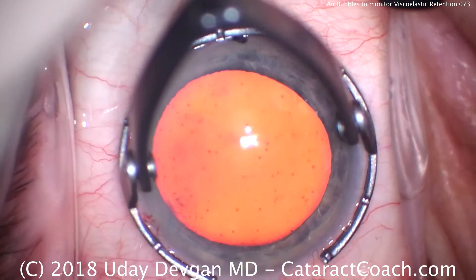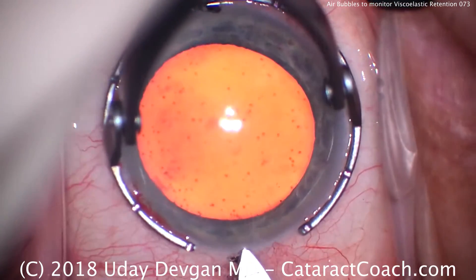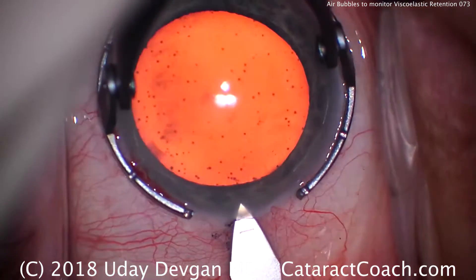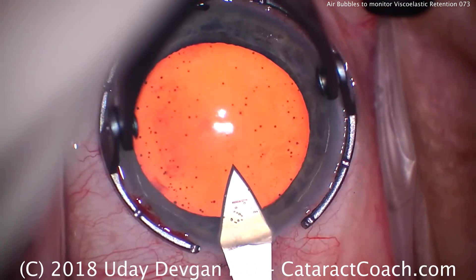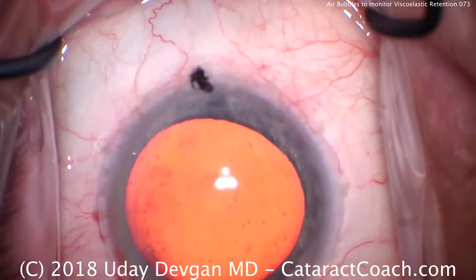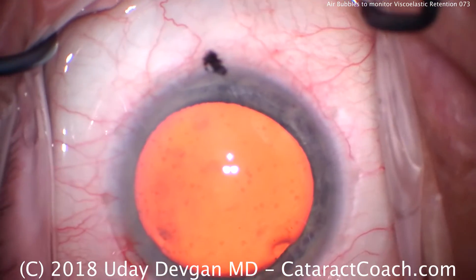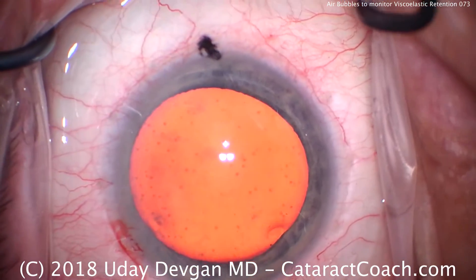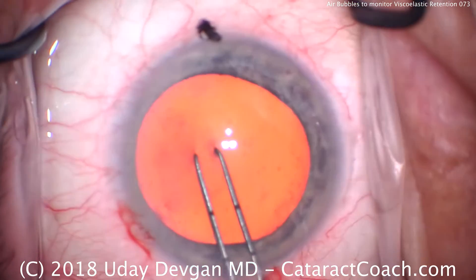This is going to enable us to monitor the retention of viscoelastic during the surgery. If the air bubbles go away, then we can assume that the viscoelastic in that area has gone away as well. In the past, surgeons have also used, in studies, viscoelastics that have stains or dyes in them to help visualize them better. But in this case, we're just using our standard viscoelastics.